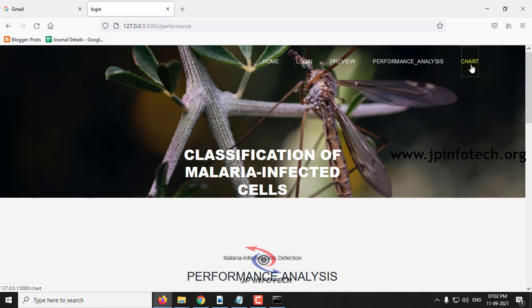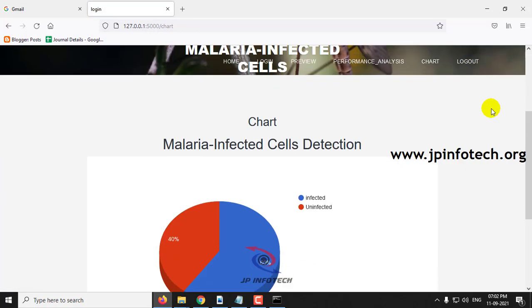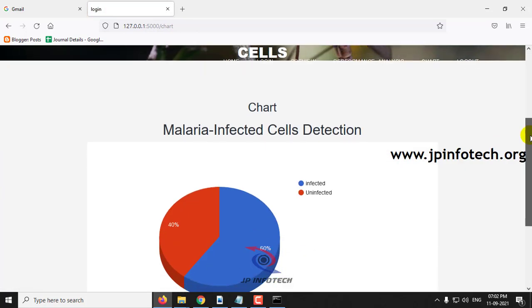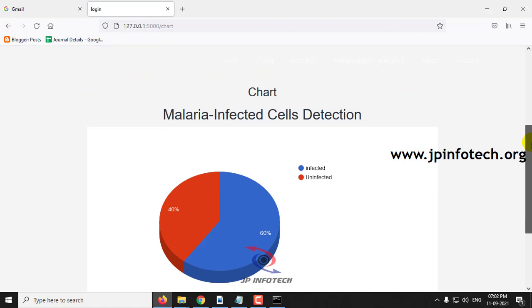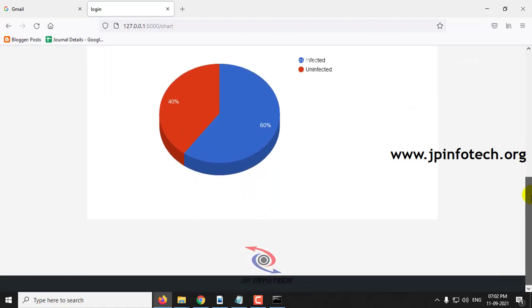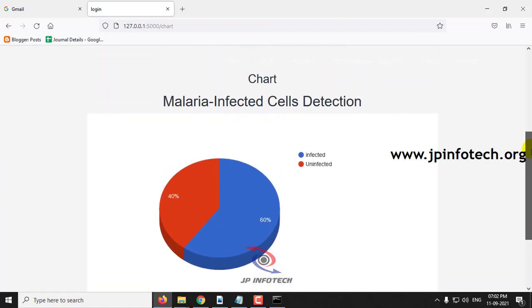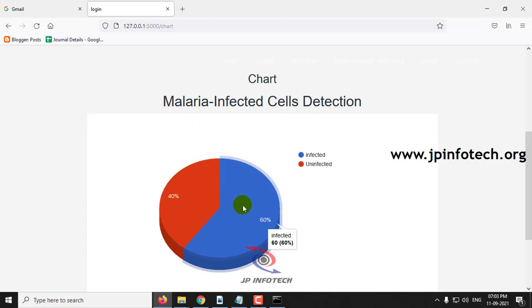At last, let me go to the chart part. This is a static chart because we have not used any database. The chart values have been depicted from the data used for training. Here you can see the dataset consists of around 60% infected images and 40% uninfected images.